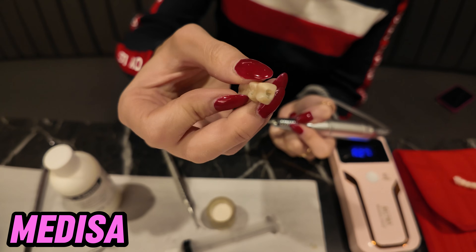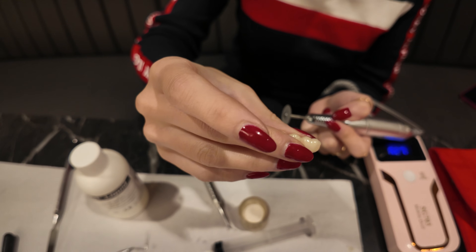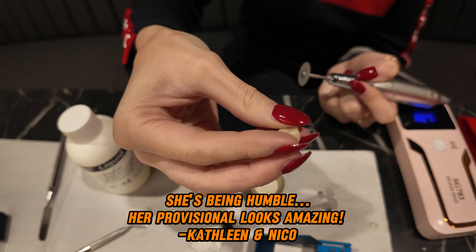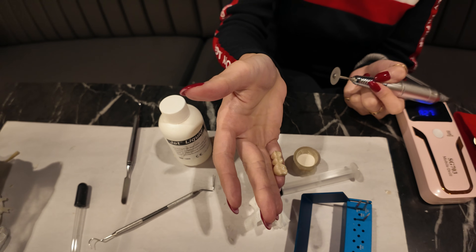I'm trying to get the embrasures on this side and this side, but the occlusion looks not so bad. I have to check it again. The contour is okay, the margins are closed. That's the finished product — 100%.